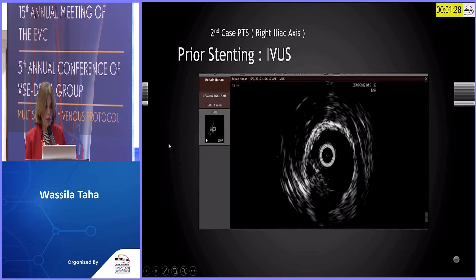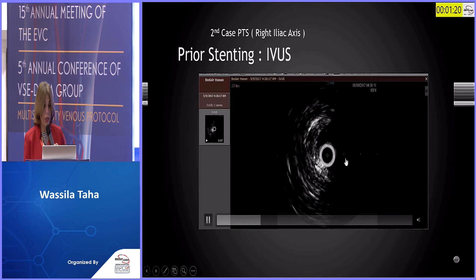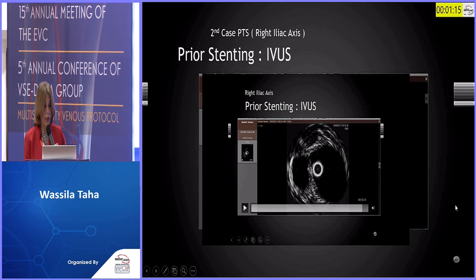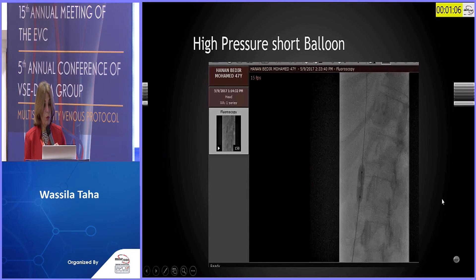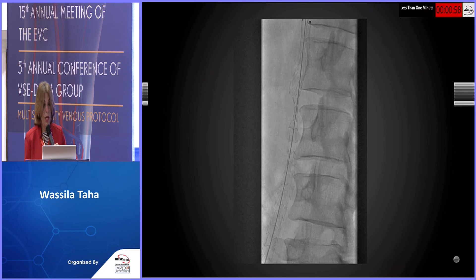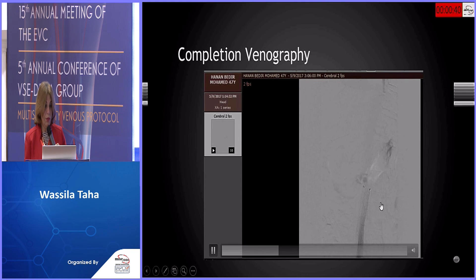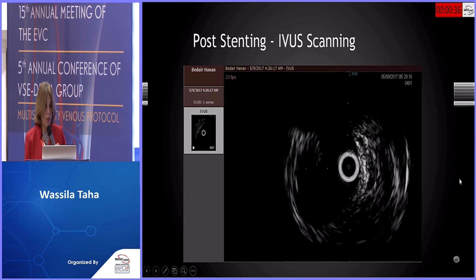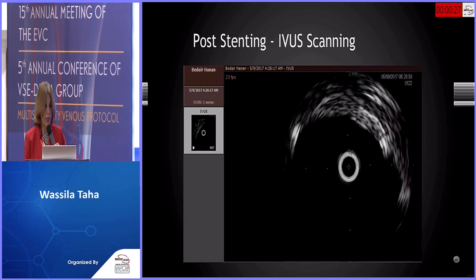Prior to stenting, we deployed IVUS and observed remnants and debris around the vessel. In the IVC — a large vein — on pullback we identified debris and remnants and calculated precisely the stent length needed. Pre-stenting ballooning was performed with a high-pressure short balloon, gradually increasing diameters. After stent deployment, significant residual stenosis was noted, so post-stenting dilatation was performed. The completion venography showed free flow up to the IVC, and the completion IVUS scan confirmed the success of the procedure by demonstrating full stent apposition on pullback.